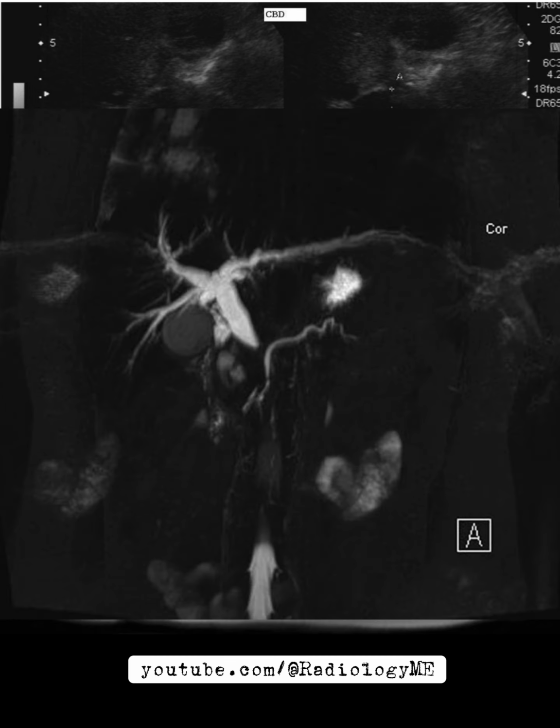Next, we proceed with magnetic resonance cholangiopancreatography and MRI of the abdomen, which give us much more detail. We see that there's significant dilation of both the intrahepatic and extrahepatic bile ducts, but as we trace the ducts down, they taper towards the head of the pancreas. This is a classic indication of a mass obstructing the flow of bile at the level of the pancreatic head.